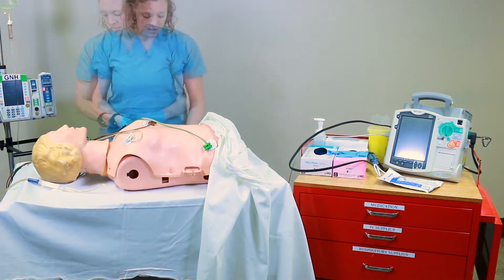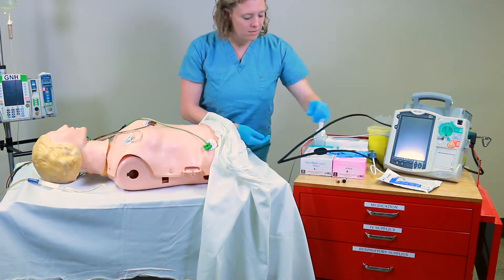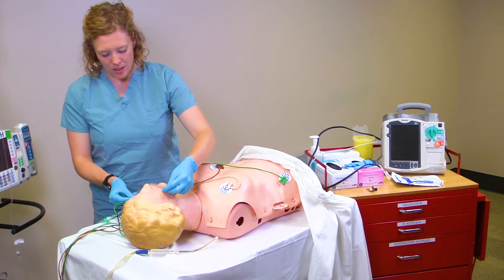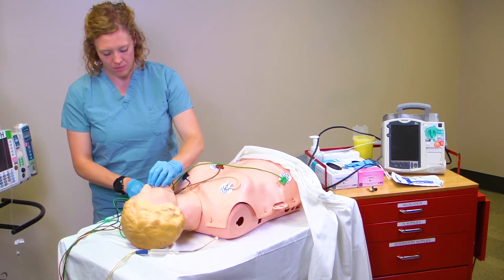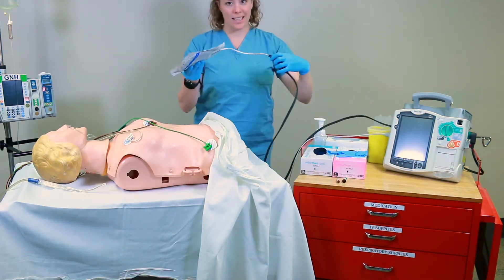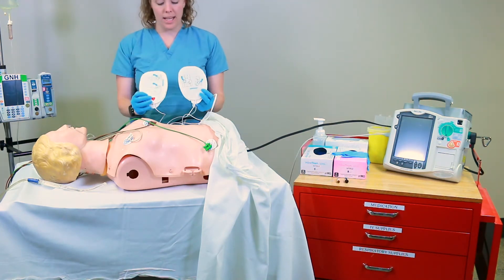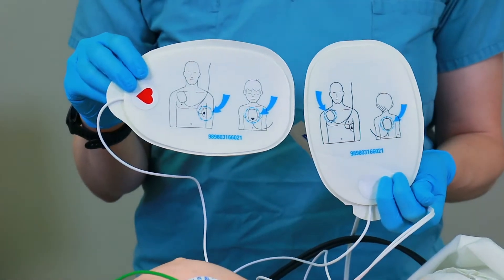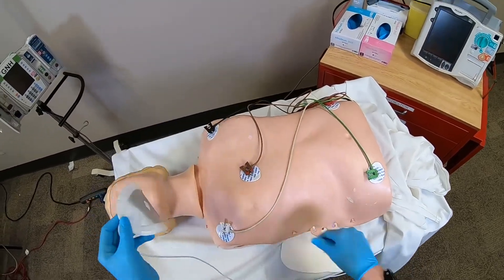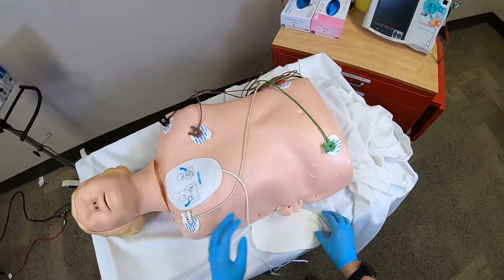Have ordered analgesic and sedative ready. Apply nasal cannula and connect to oxygen as per unit policy. Next, open and apply defibrillator pads. The pad with a heart is applied to the patient's left side and the one without is applied to the right side. Apply defibrillator pads in the anterior-lateral or anterior-posterior position.